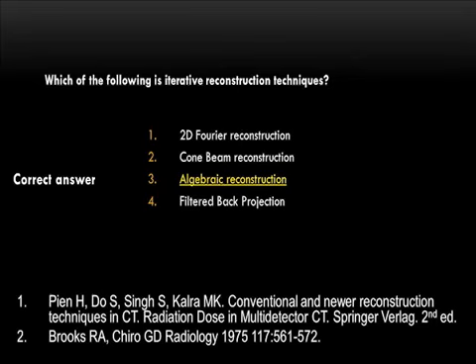since we don't have the timer and everything, I think the answer is pretty simple over here. It's the algebraic reconstruction technique, which is classified as the IR algorithm.